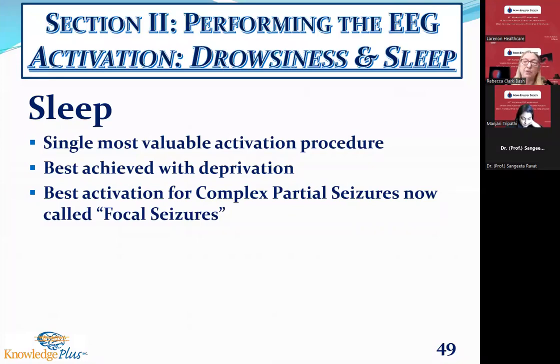Again, the hardest seizures to diagnose are what used to be called complex partial seizures, now called complex focal seizures. It's behaviors that can be very subtle, and to a lay person don't look like, you know, is that a seizure? That could be a seizure. So sleep is really critical. Now, if we don't do our job, if we don't create an environment for sleep, don't worry, they're coming back. Epilepsy doesn't go away. But if we don't catch it early, we have a smaller chance of finding effective treatment. So it's important to do our best to get all of the activation procedures performed during a study.